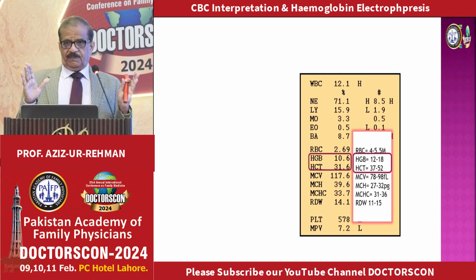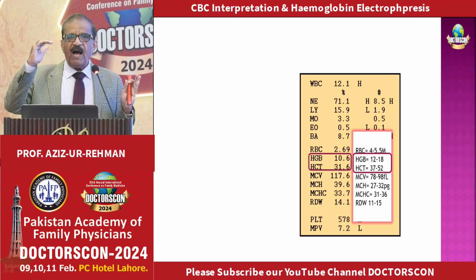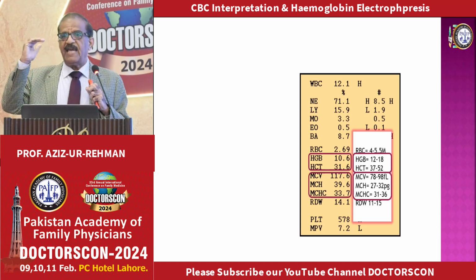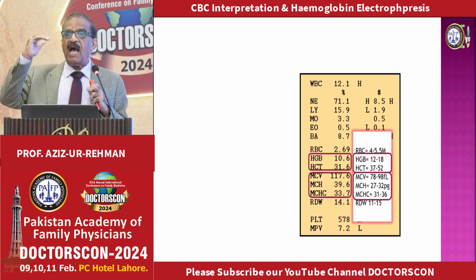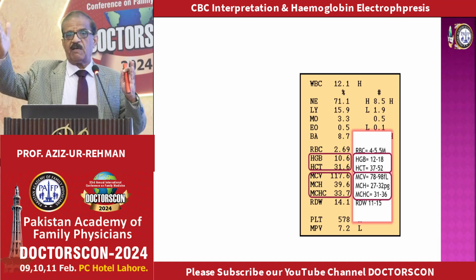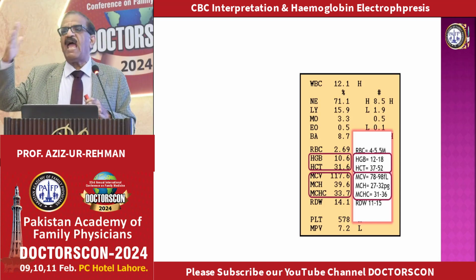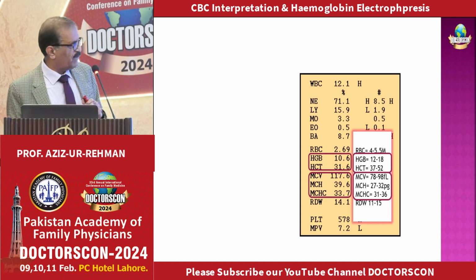So in a nutshell, in beta thalassemia, alpha chain is normal, beta chain is reduced, but gamma and delta have to increase to keep it balanced with alpha. So hemoglobin A2 and hemoglobin F are increased. So that is determined by electrophoresis.